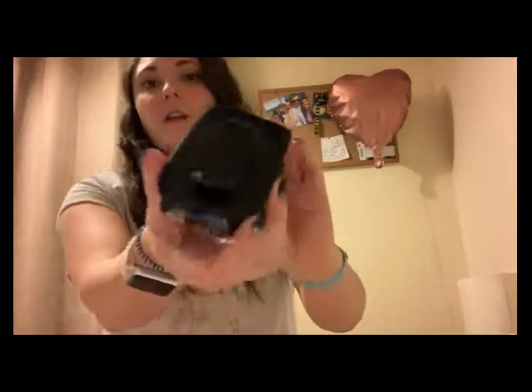I'm in the land of the living, and also I need to put a new sensor on because the old one just failed. I think I told you a while back, I've been alternating them, so I have them in my arms and then in my stomach. I've decided I'm going to put this one in my tummy, and I have this case that clips onto my belt, and then I can just press that and it scans it, so it makes life a little bit easier.